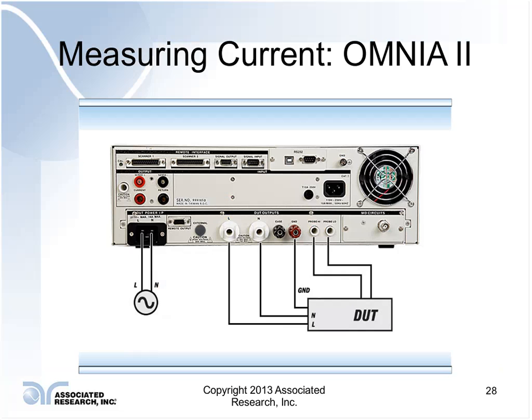So again, we would have pretty much the same setup. We have our device powering up either through an external power supply, or if I'm using this OMNIA unit, it has an internal one. That's going to power up our DUT here. We're going to have our probe high on a patient lead or a chassis point. Leakage current is going to go from here through our probe high, through the measuring device, which will be here internally, and then back here to get our measurement.